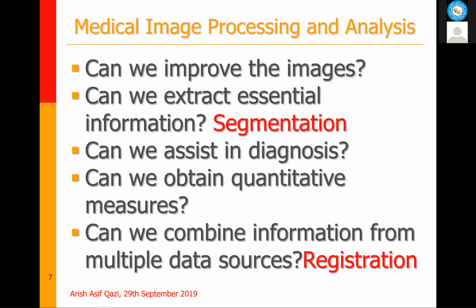So, for example, I talked about MRI and CT, and these both provide different information. So is there a way we can fuse the data from both images? This is done through image registration. What registration does is it creates a transform that maps locations from one image to corresponding locations in the other image. It takes these two different coordinate systems and maps them into one coordinate system.